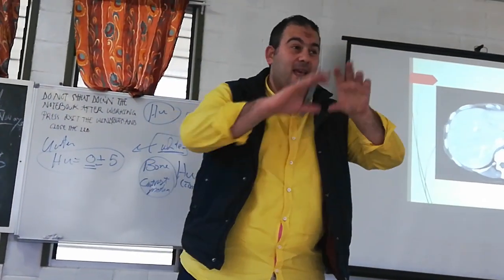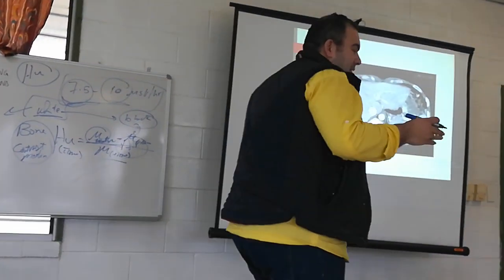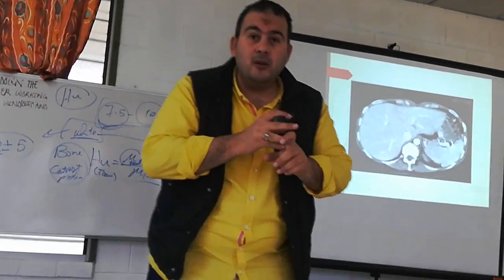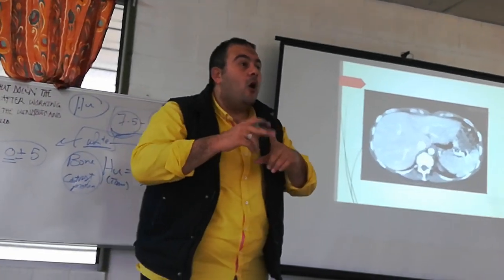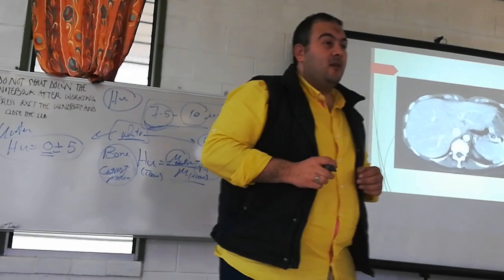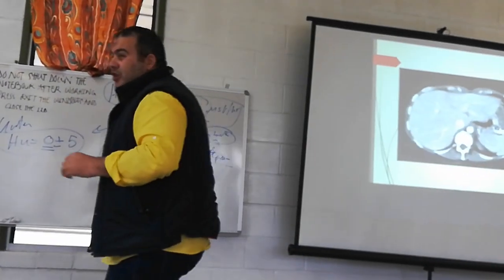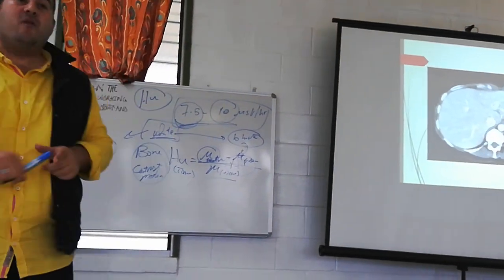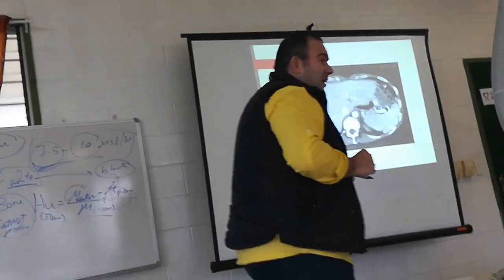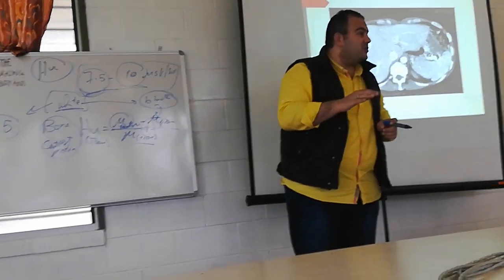As you know, the designers of the CT machine know well the attenuation coefficient for water, for bone, for fat. All tissues inside our bodies have a specific attenuation coefficient. Substituting this value in this equation, you will get the Hounsfield unit. You will find a specific Hounsfield unit for hematoma or hemorrhage, for stroke, for any pathology.